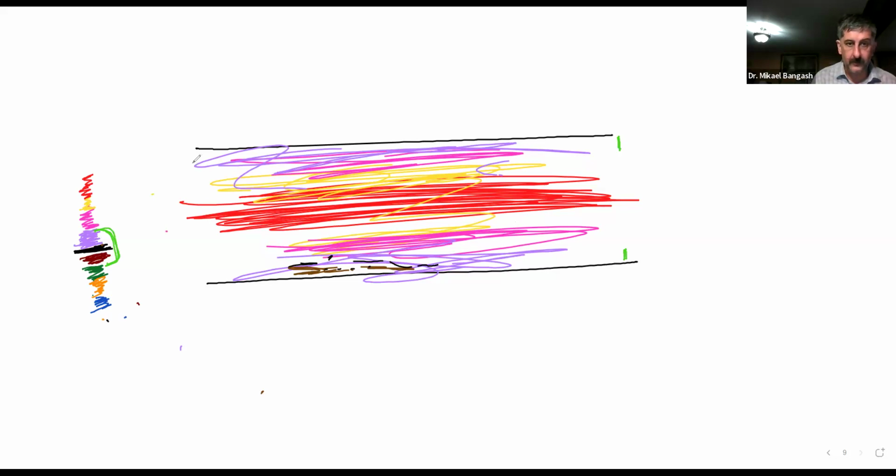And what do you end up with? This blood vessel may not appear as well filled with blood flow, but may start appearing as if the blood flow through it is lesser, mainly because these low velocities here were filtered out. Did that make sense?